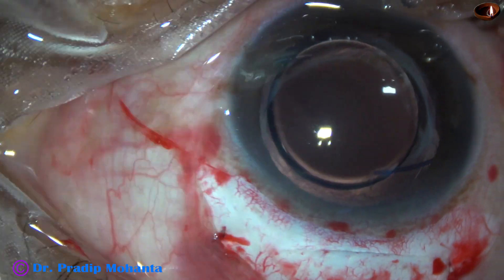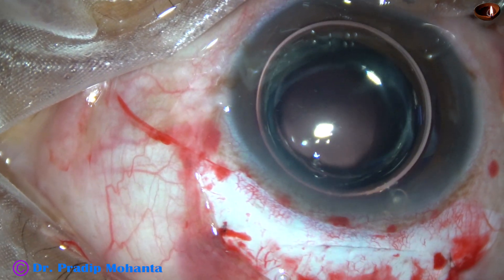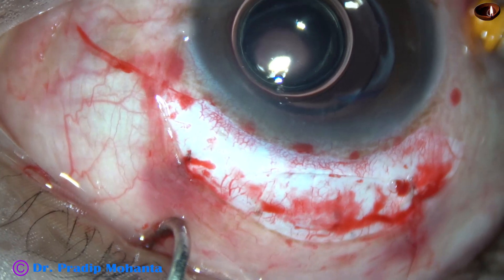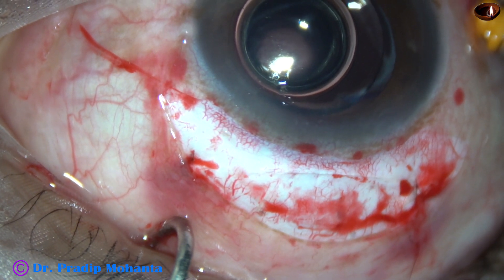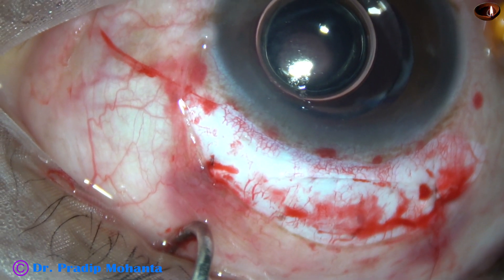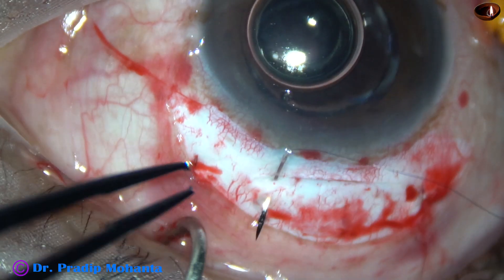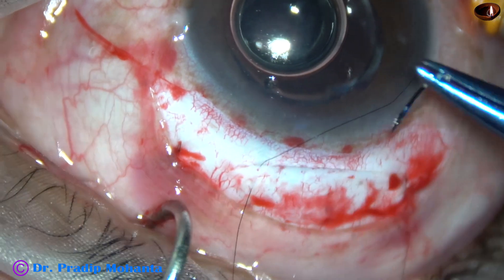My plan now is to suture the main wound. Let the pupil constrict and we can judge if there is any vitreous strand in the anterior chamber. In this case, I did not use triamcinolone acetonide. Now I am closing the sclerocorneal tunnel by a continuous shoelace suture.